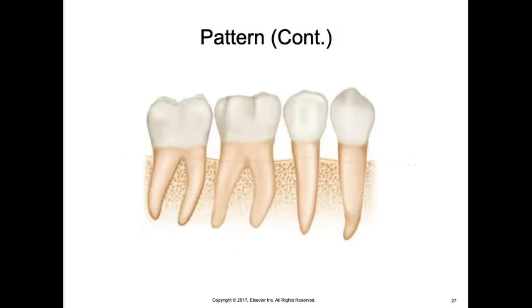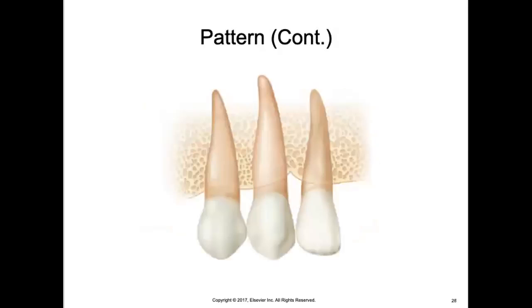Here is another example of that, a bone loss here. The CEJ plane is this area here, right where the enamel meets the cementum. So if we have a parallel line of remaining bone, this is what's known as horizontal bone loss. Figure 34-13 in your book shows a representation of what vertical bone loss looks like. If we see the height of the remaining bone here, this line is not parallel to the CEJ level here. So for a representation like that, this is known as vertical bone loss.